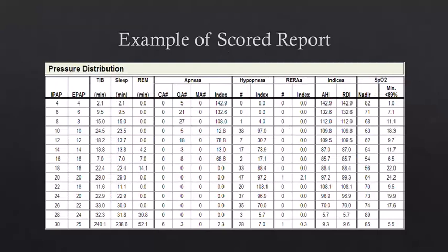Here's an example of a patient that was really severe starting off. So the technician was pretty aggressive with increasing the CPAP, going from 4 to 6 to 8, all the way up to 20, and rightfully so, because the patient was still very severe. At 20, the CPAP maxed out, so the tech switched them over to 22 over 18 and continued to aggressively titrate. In the beginning, this absolutely was warranted because the patient had a lot of obstructive apneas, back-to-back events, resulting in very high RDI.